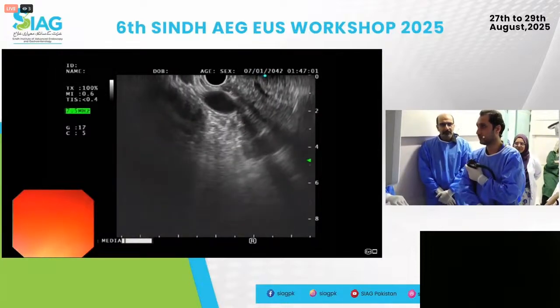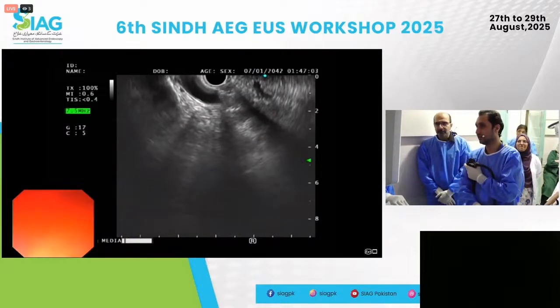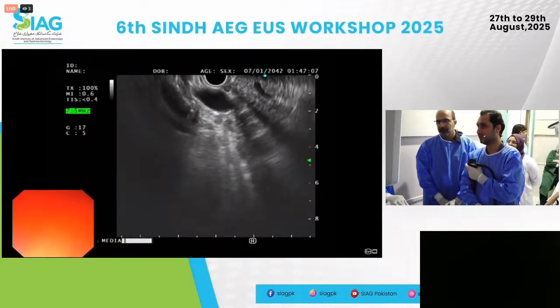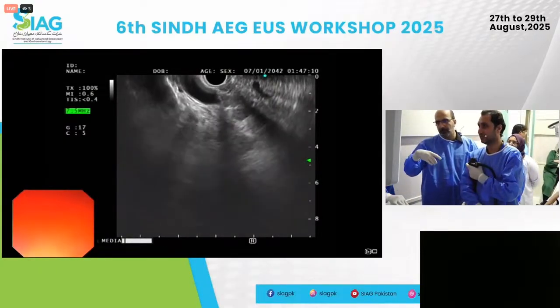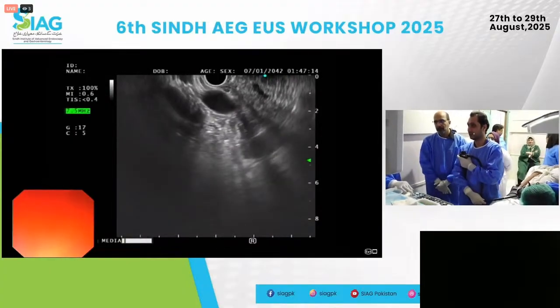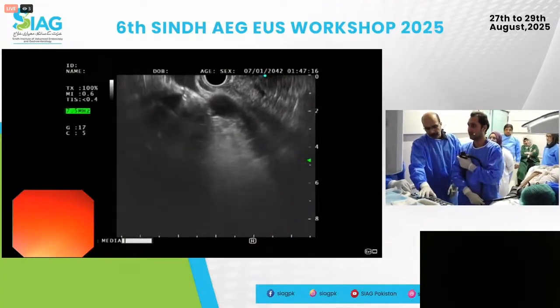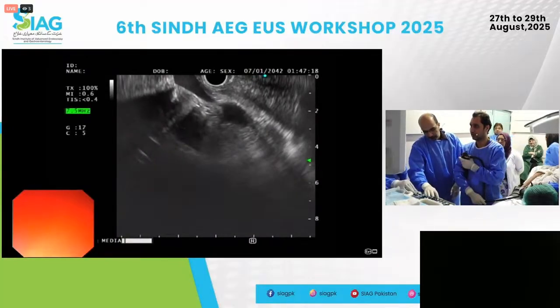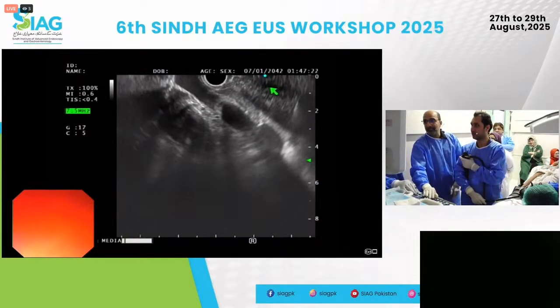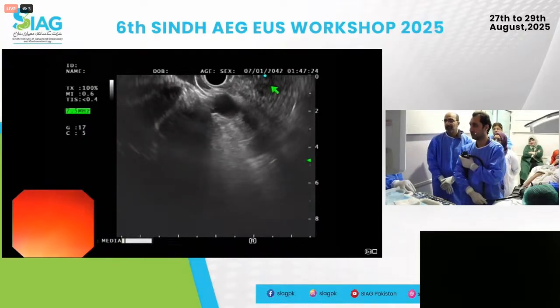So what do you see here? I think that's aorta. Okay. Is that so? I can't tell, to be honest. If you think it's aorta, usually you want to go clockwise for the pancreas. What do you think is above it, though? Where's the cursor? Sorry, Mustafa. Yes. Can we have Doppler? Yeah.